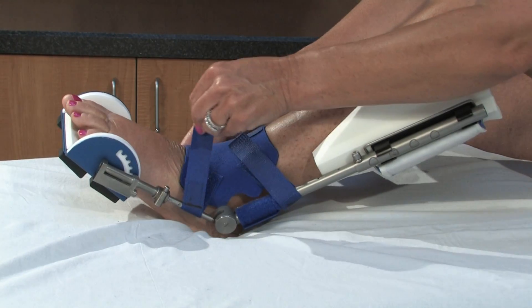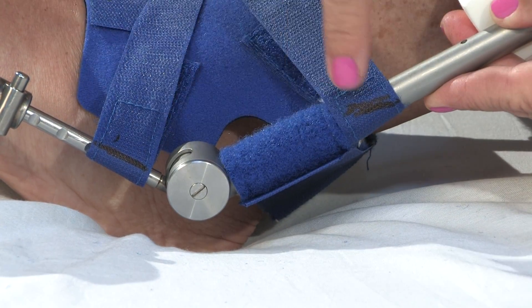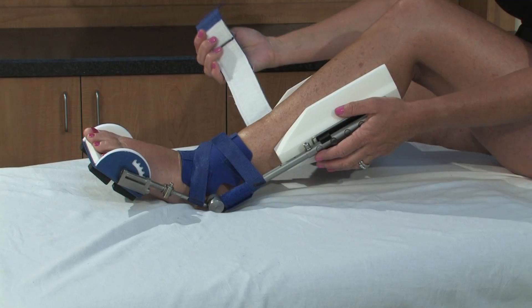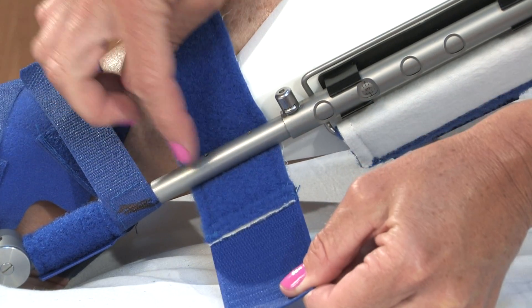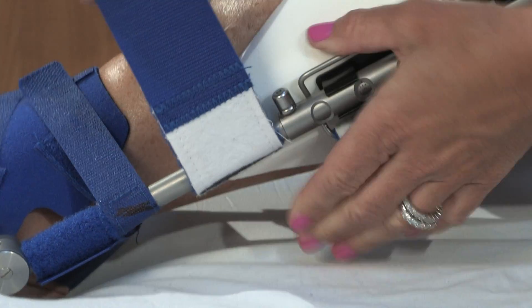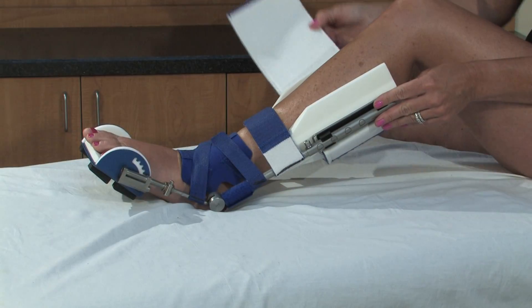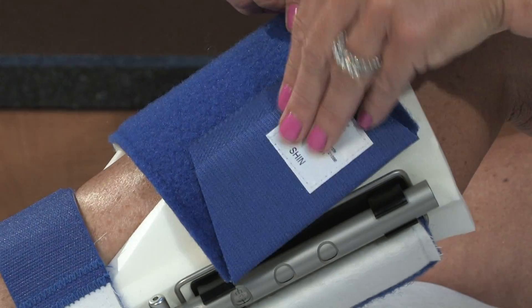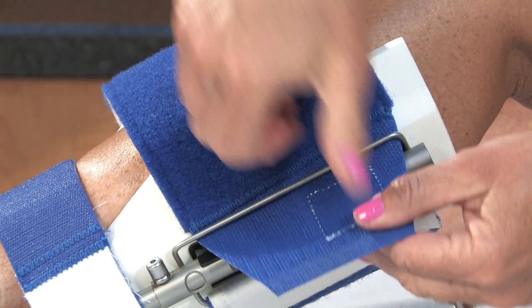Snug the butterfly cuff using the two one-inch straps. Pull them until you see the line drawn by your sales consultant. Next, attach the two-inch strap by running the end under the strut and attaching it to itself. Snug until you see the black line.